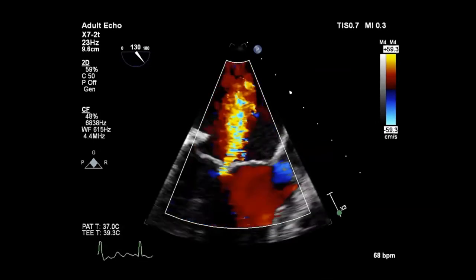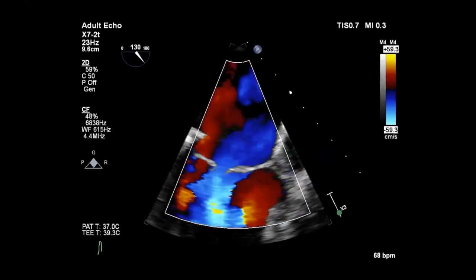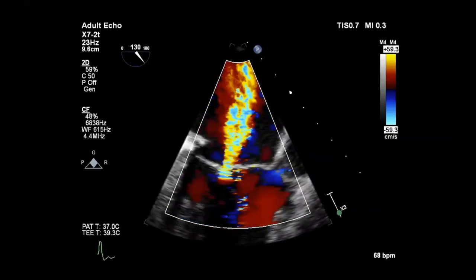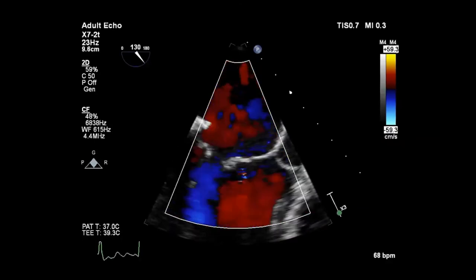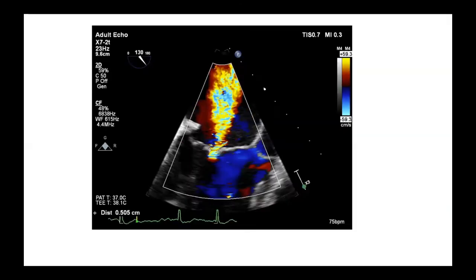The color jet looks quite severe. We've measured the vena contracta here at 0.505 centimeters, which is in the moderate range. But with grading mitral regurgitation, it's important not to just have one measure — you have to look at jet area and flow convergence on the vena contracta. It's multiple parameters that determine whether it's mild, moderate, or severe.